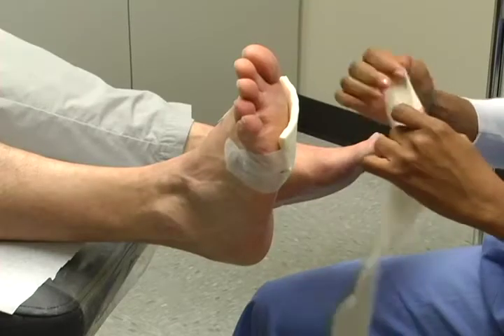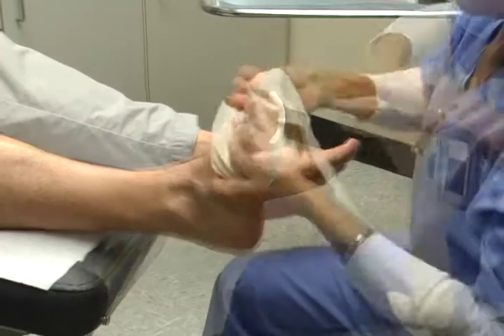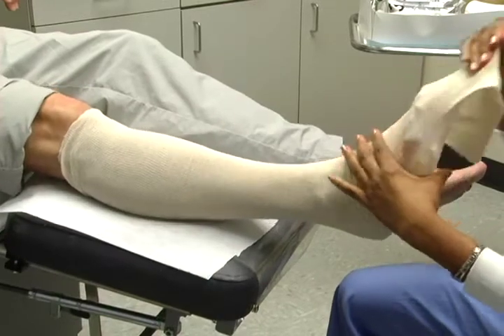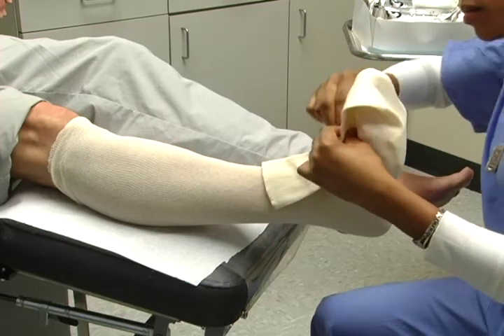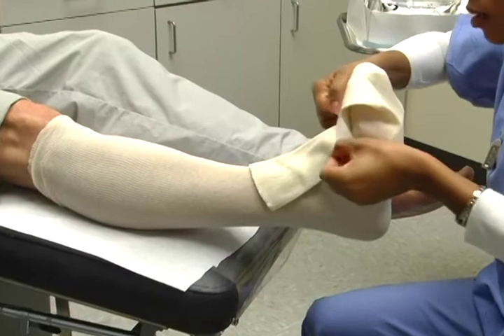Step 2. Tan Stockinette. Next, gather the tan stockinette and slide it over the foot and leg up to the patella and smooth out any wrinkles. Fold the distal end of the stockinette over the dorsum of the foot. Secure the end using plastic tape and cut the excess.